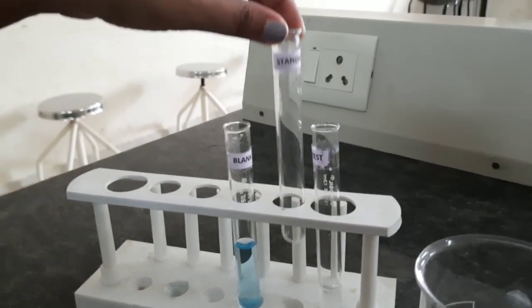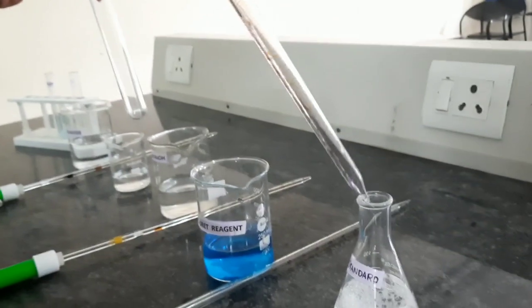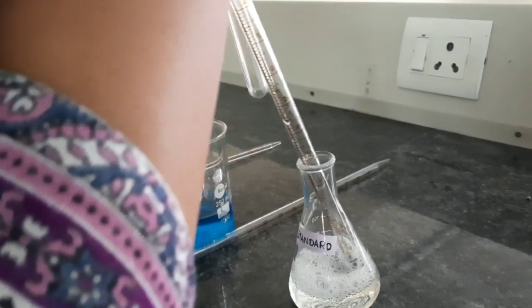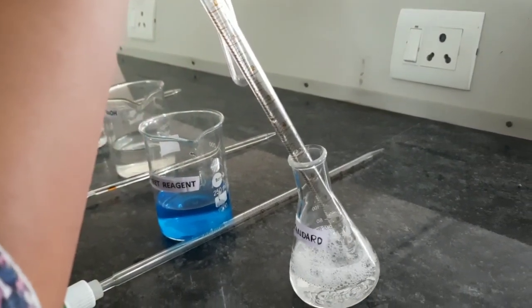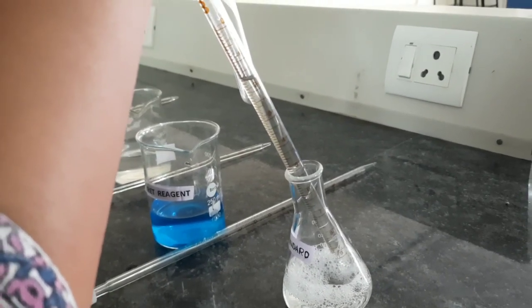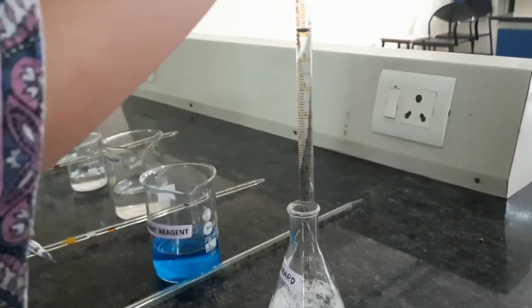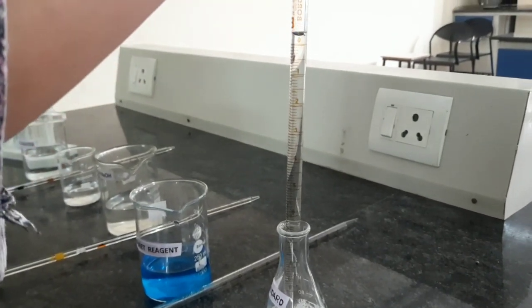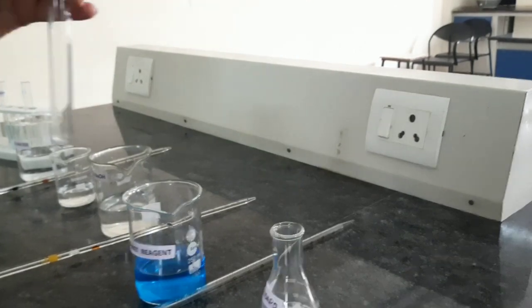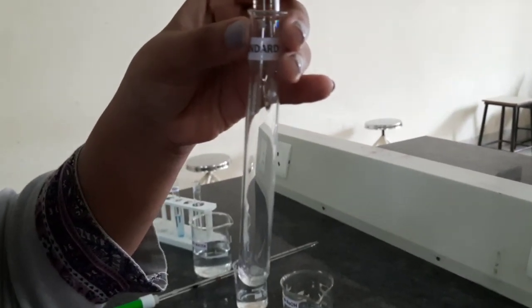Now we are going to take the standard tube. To the standard tube, we will add the 1% standard protein solution that we have prepared. Here we have used bovine serum albumin to prepare the standard. So 1% of bovine serum albumin is going to act as our standard. 3 ml of bovine serum albumin standard is taken in the test tube.